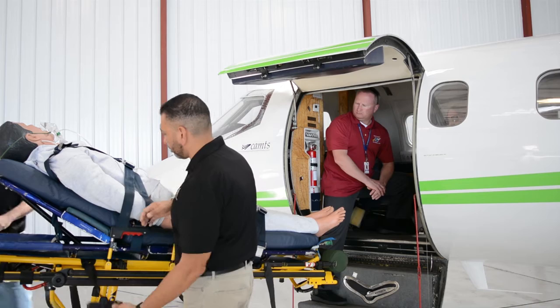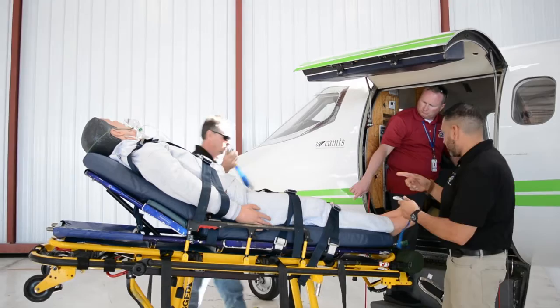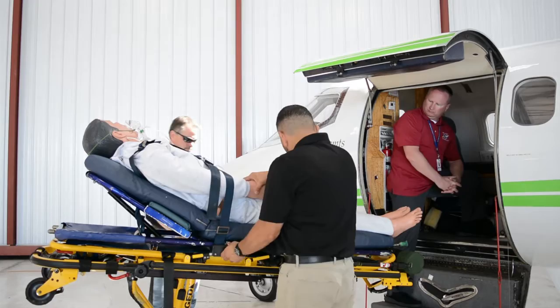Again, this patient has a non-rebreather, so we want to make sure that we have proper oxygen set up for that patient. You can see I'm taking off, and Greg has already taken off, the shorter blue straps that are retaining the top sled to the gurney. We're going to drop our side rail to the gurney.